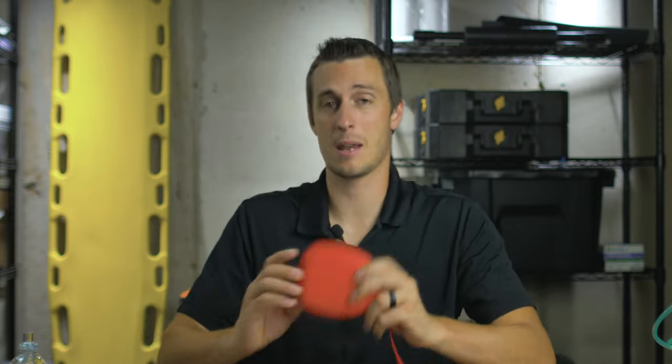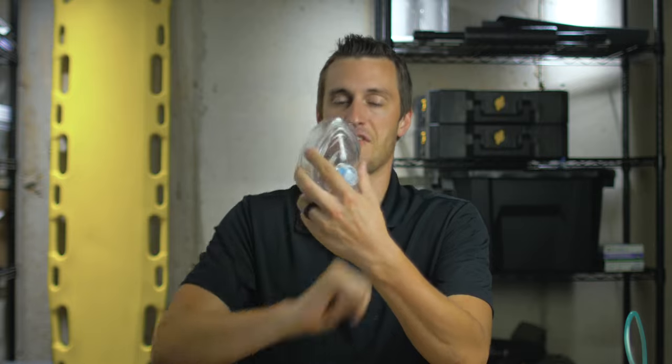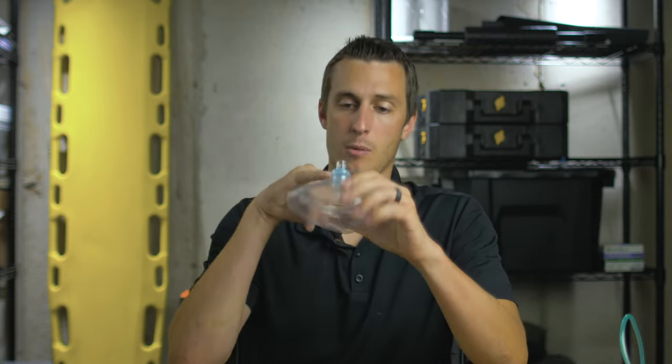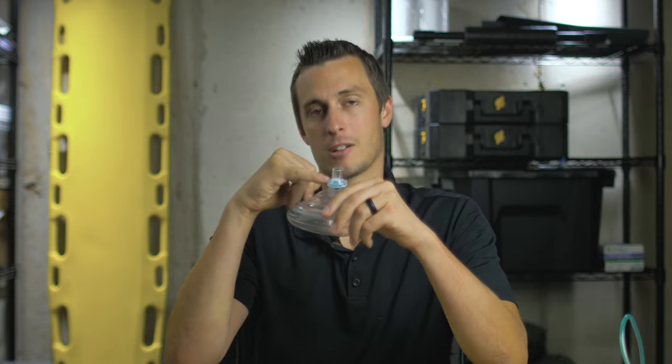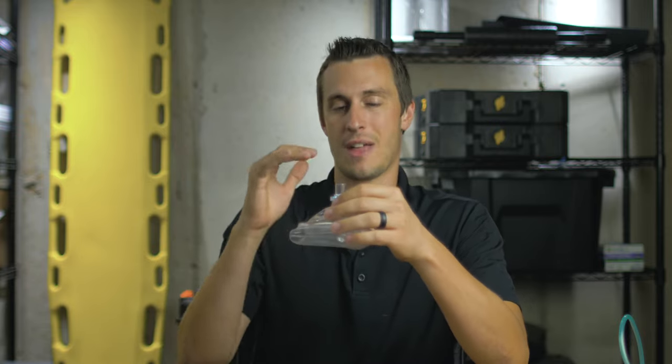An alternative to a BVM that takes up a lot less space is a pocket mask. They usually come in a small case, and once pulled out they look something like this. The pocket mask sits over the bridge of the nose and right up underneath the mouth, creating a seal around the face. You as the rescuer use your breath to positively ventilate the patient. There is a one-way valve and a filter right here to prevent any aspiration, diseases, vomit, or anything from coming back from the patient to you, so that will help keep you safe.